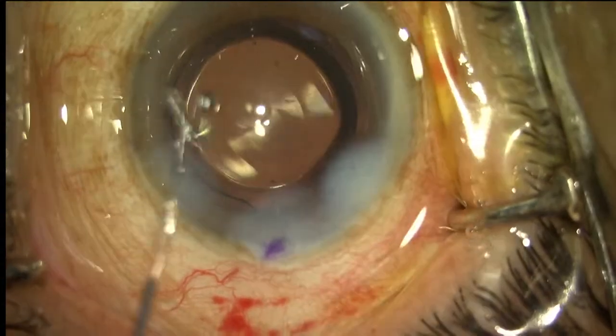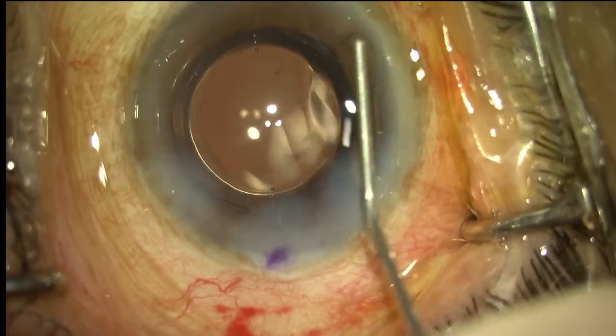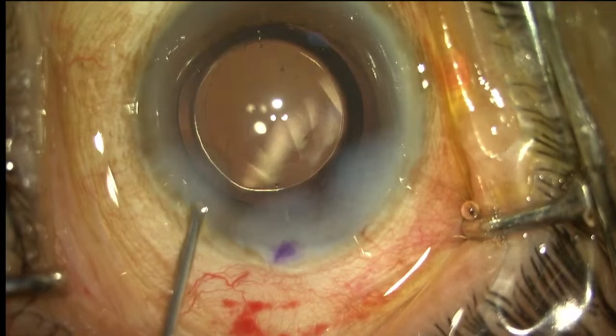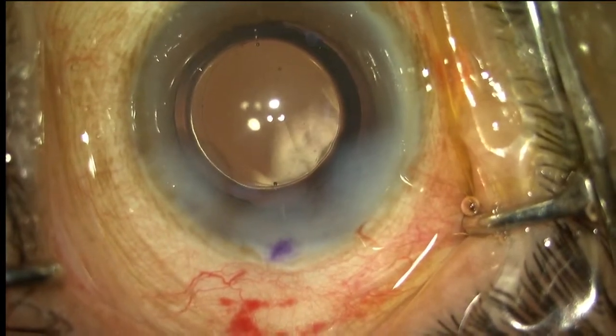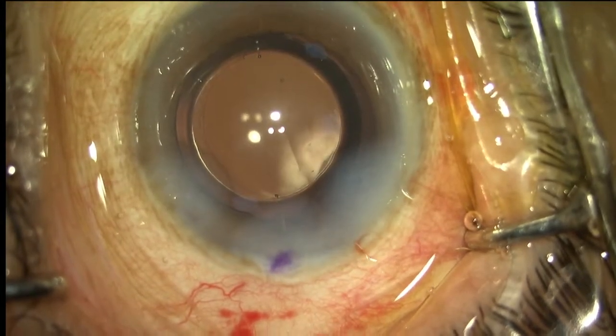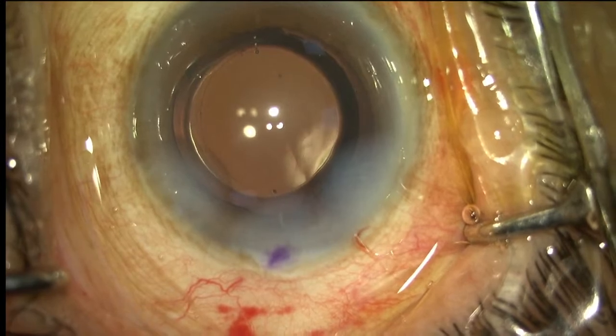In this particular patient, a little bit of 3-degree rotation is still expected. JNJ is coming up with a new platform where that will also be improved. So this is the end of the surgery. You can see a very well aligned IOL, and that's it.